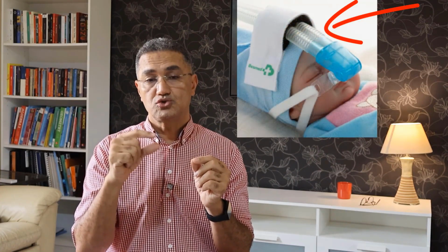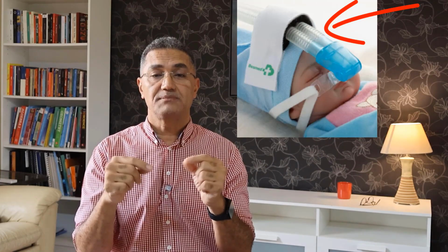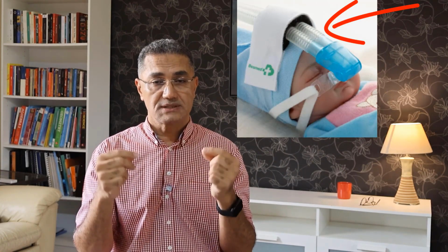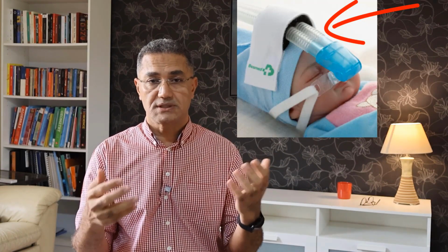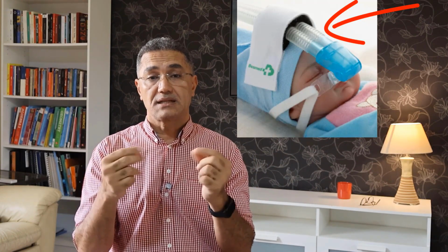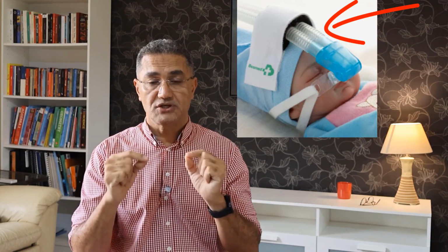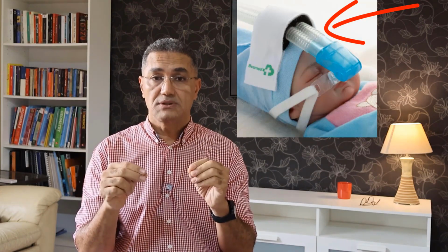If you look at patients using a nasal cannula, whether it's size 2, 3, 4, or any size at all, you'll see the nasal cannula is inserted into the patient. This is very important because for patients using a nasal cannula, instead of completely sealing the nostril, the cannula should be about 50% of the diameter of the nostril opening. This way, we leave space for exhalation. The cannula delivers inspiration, and the patient can exhale on their own. If we seal it completely, there won't be any chance for exhalation.